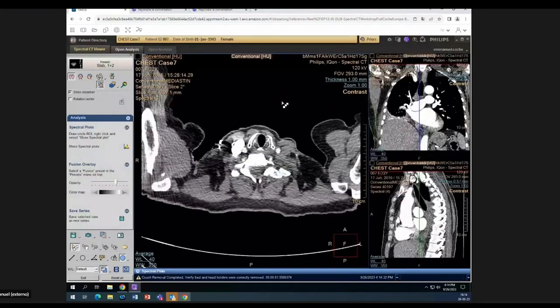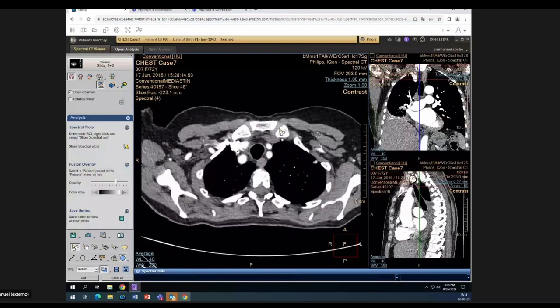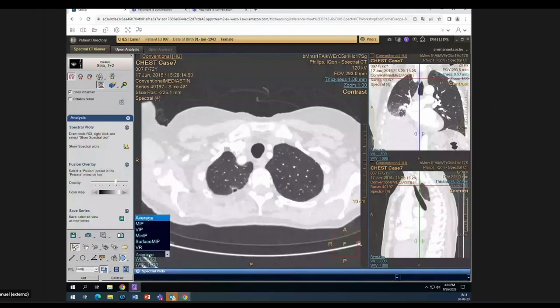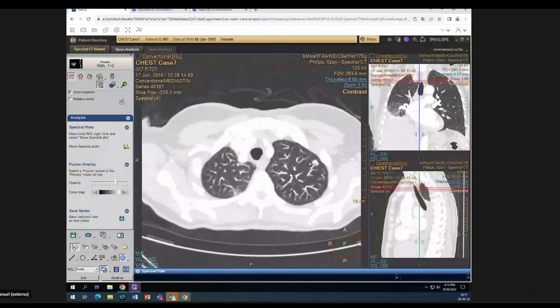This patient has been operated. I suggest going directly to the lung window settings. You write 6. And you know that you will increase your sensitivity if you go to MIP mode. You go to MIP mode, left-hand side button, MIP. You increase your slice thickness by the shift button, left-hand side button. You go to 10 millimeters, for example. You go to the scroll button. You select it there on the left side, and you see there is a lung nodule at the left apex. You go down.